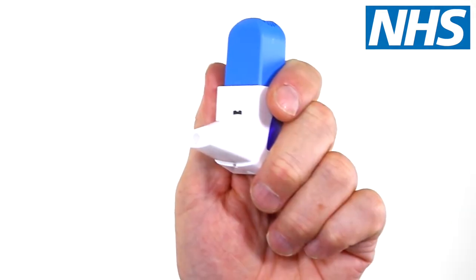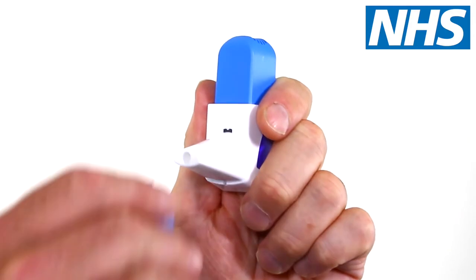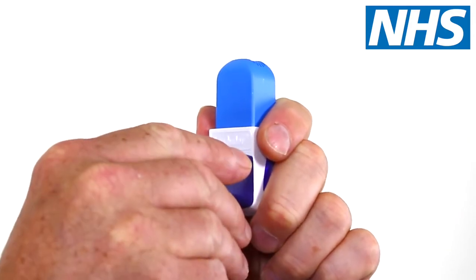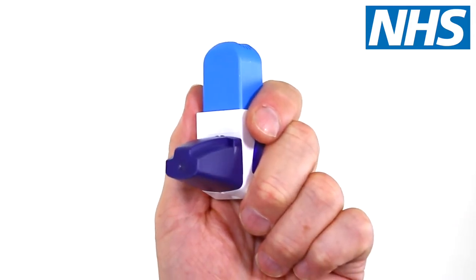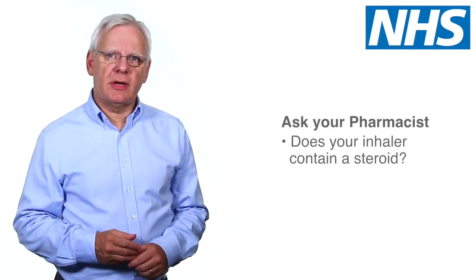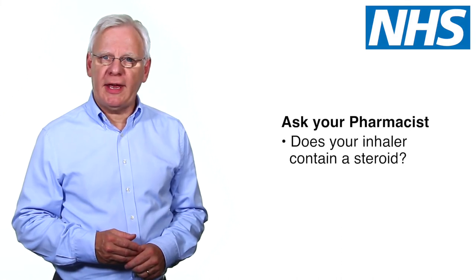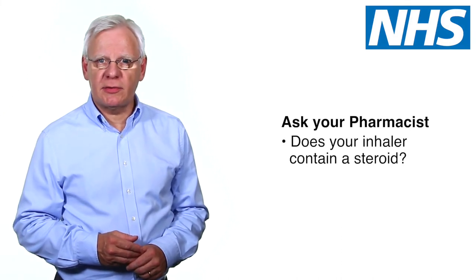As soon as you are finished, replace the dust cap straight away and the protective cap if you are using one. If your inhaler contains a steroid, brush your teeth or rinse your mouth with water and spit it out after every use to prevent mouth infections. Ask your pharmacist if you are unsure whether your inhaler contains a steroid.